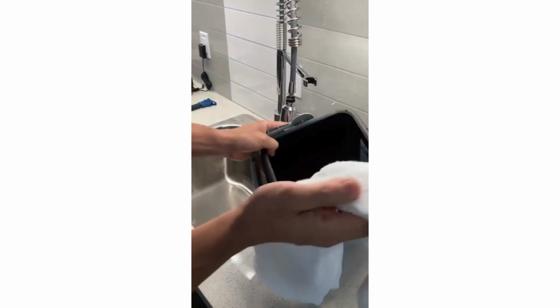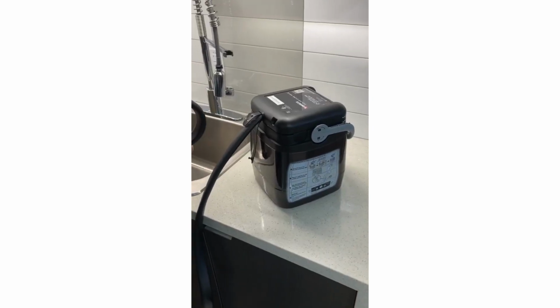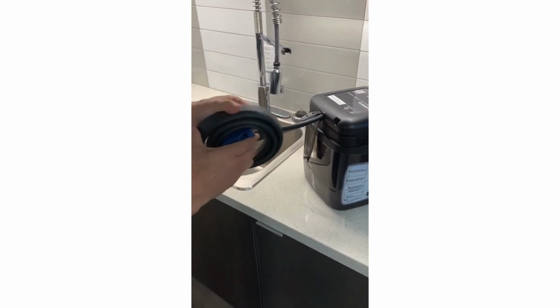When storing the device, drain any water from the unit and wipe away excess water. Coil the tubing. For PolarCare Wave, use the strap to secure.